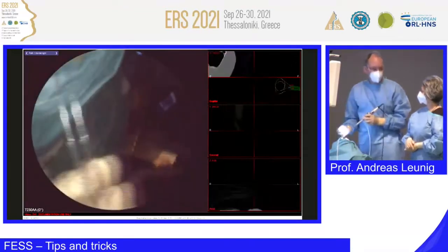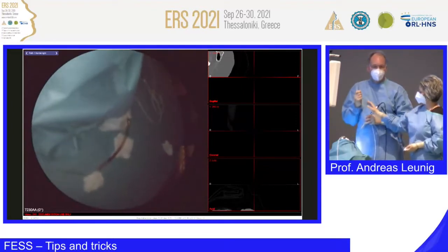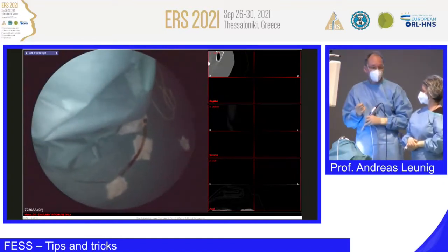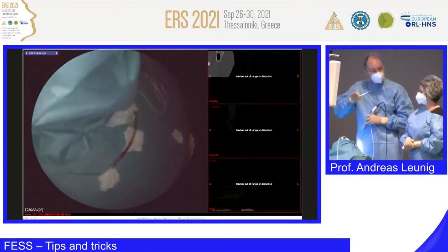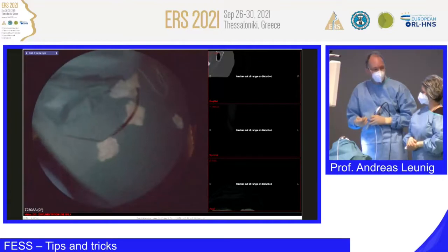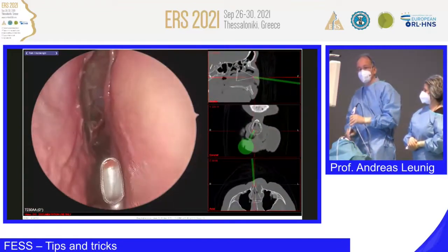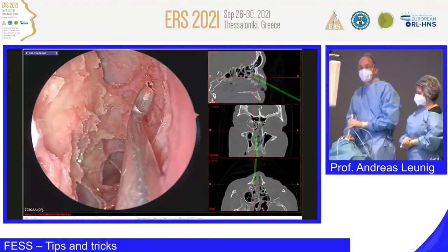And I have to mention, the Storz team told me, these instruments are not registered for skull base surgery, but this can happen. So usually you don't do this, but they are at this moment not registered. So you have to wait. There's a big process going on, and it will come. It will take maybe a year or even longer, but this has to be mentioned. It's very important. So now we have done a CSF leak, but this was just for demonstration. You have seen this, yeah? It's up here. That's a very, very dangerous area, yeah?